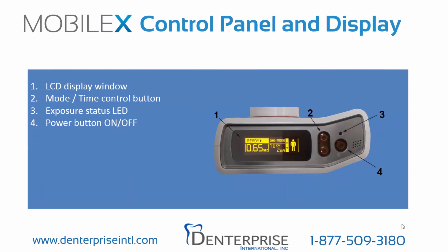On the top, we see the control panel and display. First, the LCD display window, which shows the current exposure time, the mode or patient body type, and the voltage and amperage. Second, we see the mode and time control buttons. Third, the exposure status lamp. And fourth, the power button, on or off.